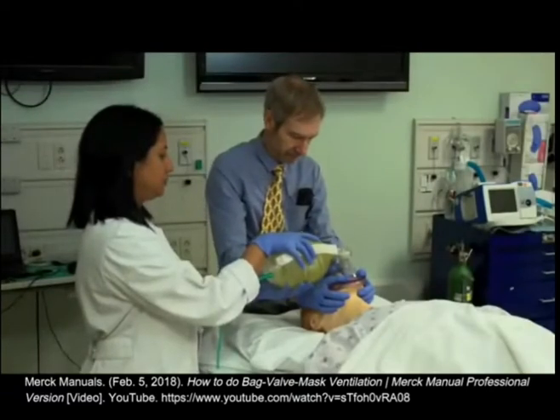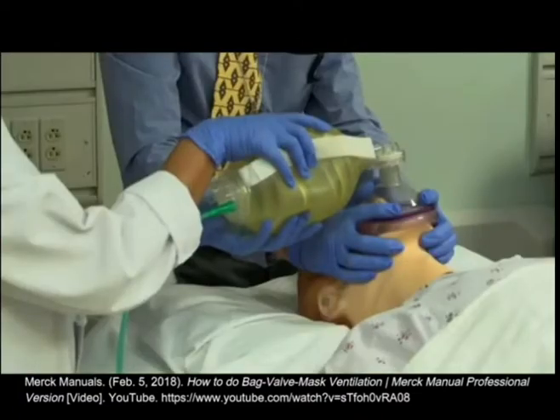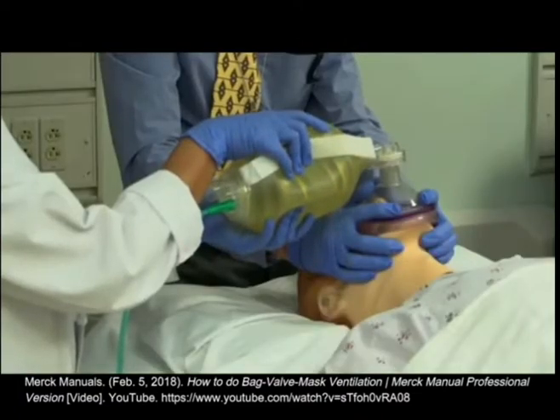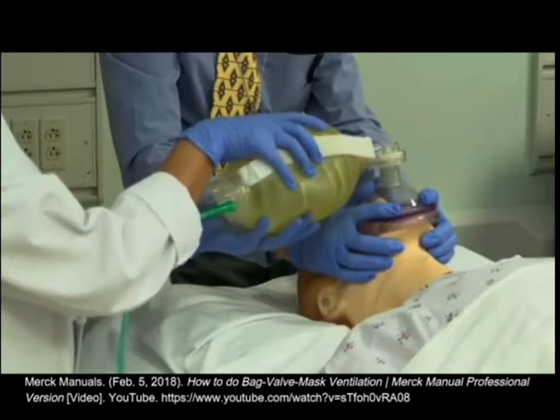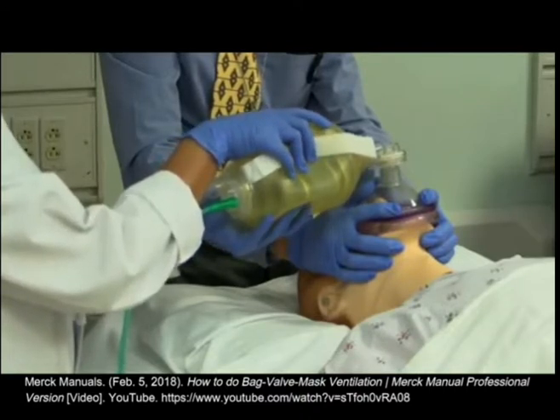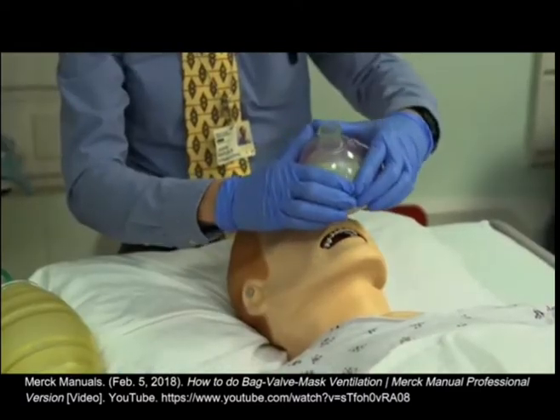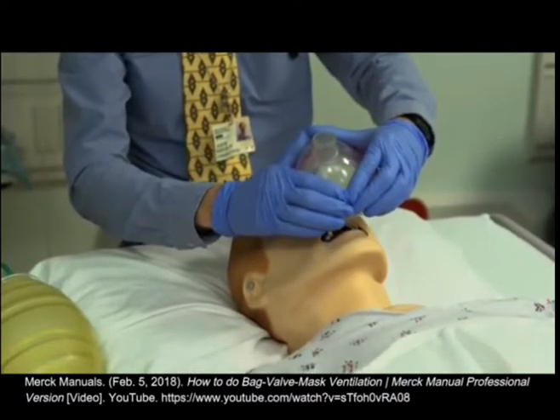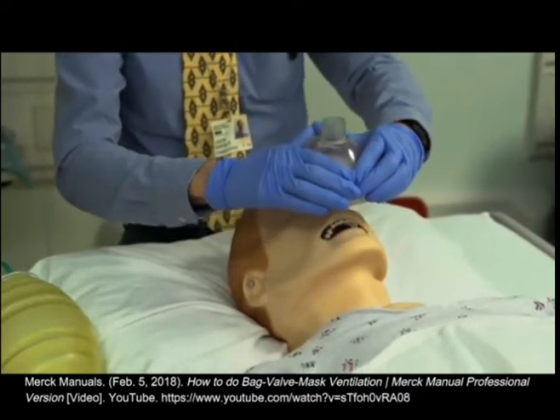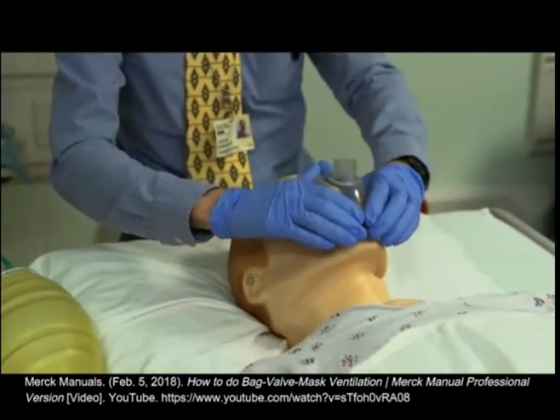Two-person bag mask ventilation is easier and more effective than the one-person method and should be done if possible. In this technique, one clinician maintains a proper mask seal while the second clinician squeezes the bag. The more experienced clinician should handle the mask because this is the most difficult part. The first clinician holds the mask in a fashion similar to the one-person technique. The web spaces of the thumbs and the index fingers are placed adjacent to the connector stem, and the mask is lowered onto the patient's face, nasal portion first.